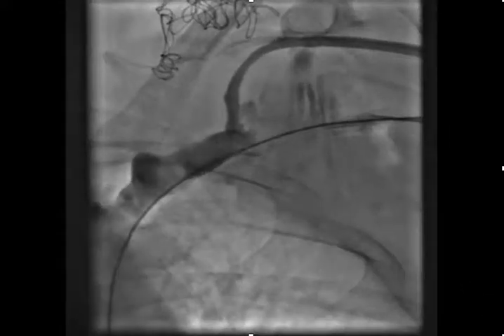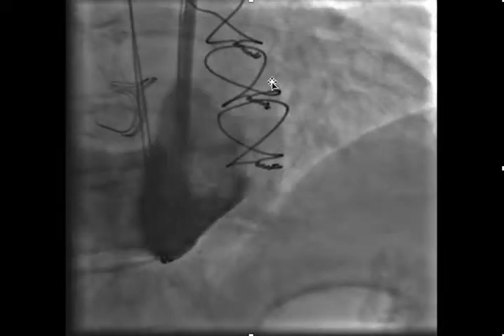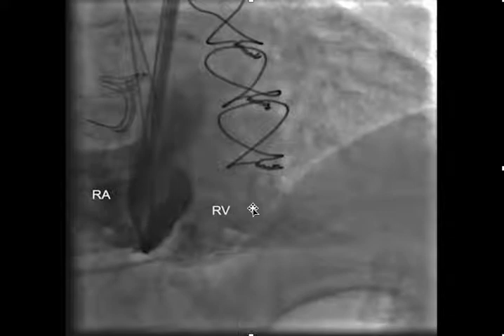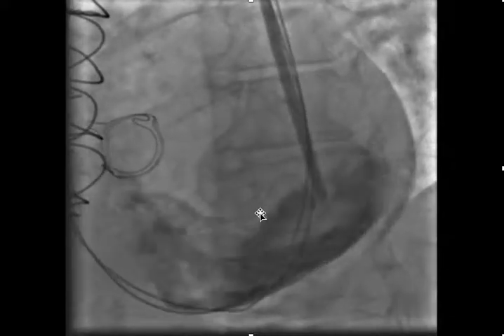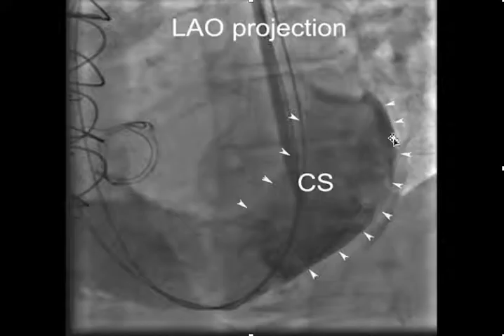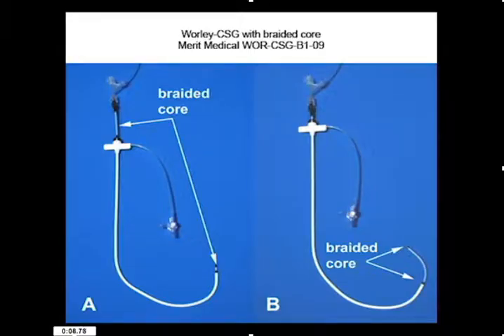Here's the initial venogram — we got access and we're injecting contrast to demonstrate the size of the coronary sinus. Here's the right ventricle, the right atrium. In the LAO projection you can see this is the lateral wall of the left ventricle with a massively dilated CS.